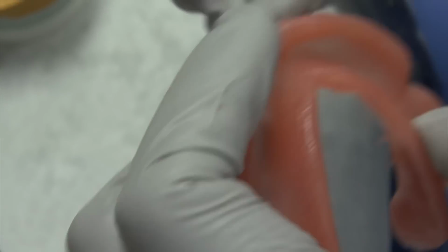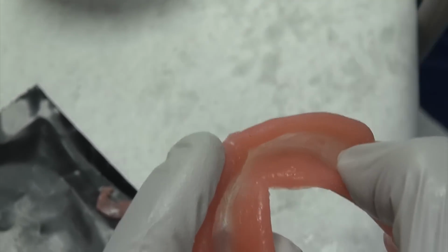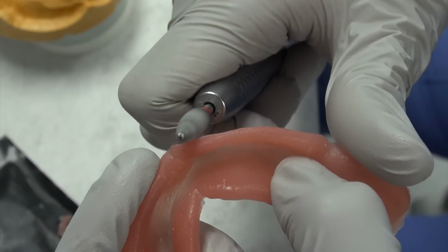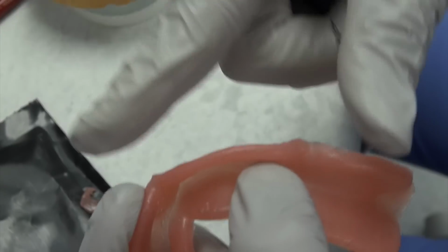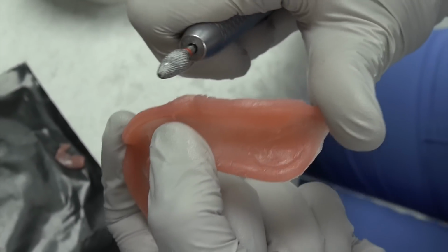Okay. And then after each little bit, you want to rub your finger. I can still feel a little bit of a roll there. And I mean, God, it's literally the most trivial amount, but it counts. And when they're testing you, this is how they're going to do it. They're going to come, they feel something, that's a deduction. Okay, feel that sharpness. Oh, look at that sharpness, deduction. Okay.